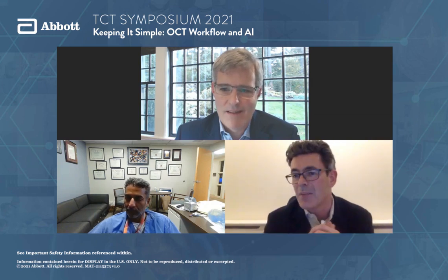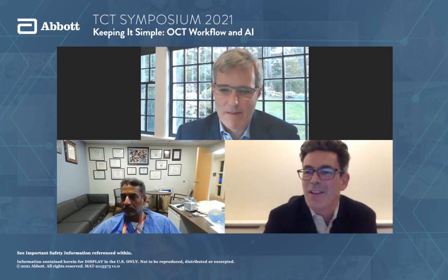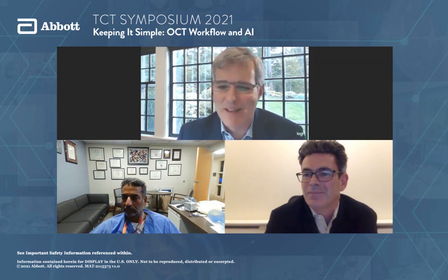I know that this happens in Richard Shlofmitz's lab, that a lot of their cases are guided by the physiologists, the technicians selecting the sizes from the generated images. Yeah, it's a really nice fulcrum and focal point to get your team engaged. That's where I think the future lies.